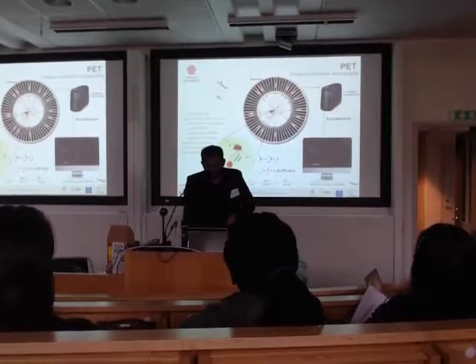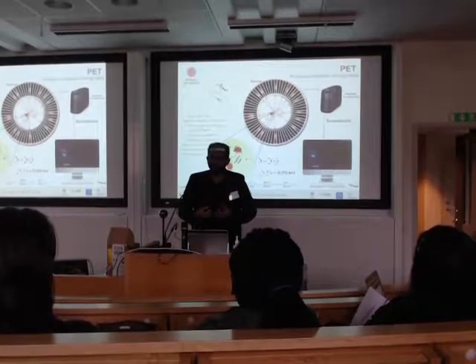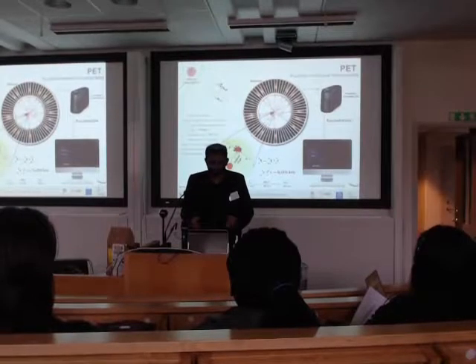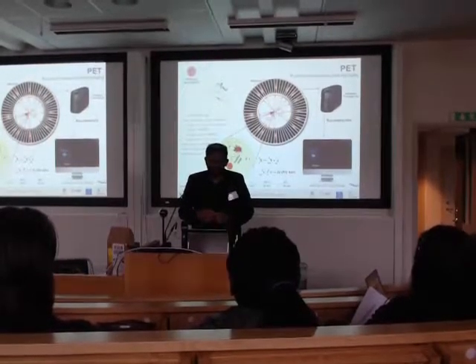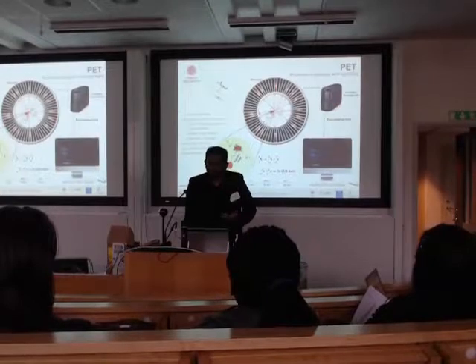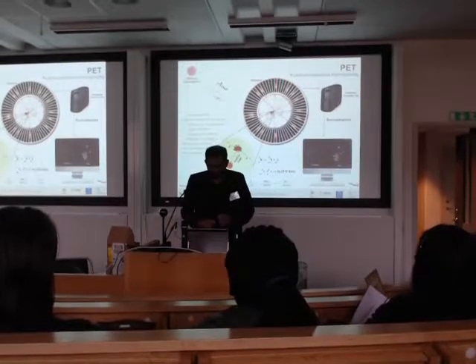And this is the beauty of PET. Here you can follow the kinetics of your tracer right from the time of injection in the vein, it accumulates in the heart, and through the aorta it distributes to the different parts of the body. This is an amazing thing to see. If you look at the image right now on the screen, you can see from the time of injection, the fluoride is getting accumulated at the site of fracture. So here you can get the dynamic image from the PET as well as static, like how the tracer profile looks 30 minutes post-injection.